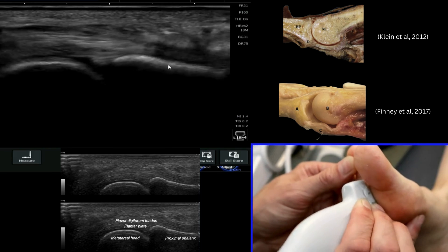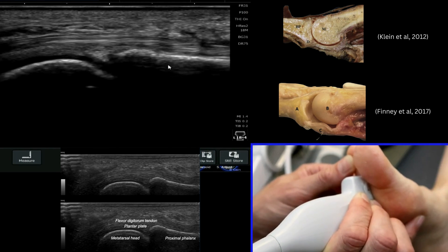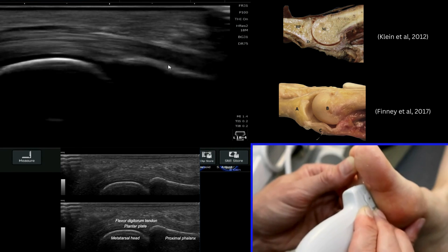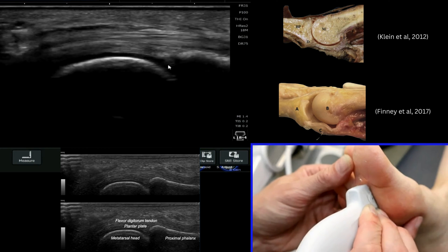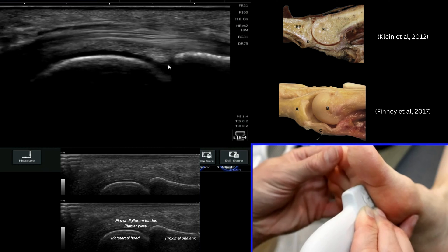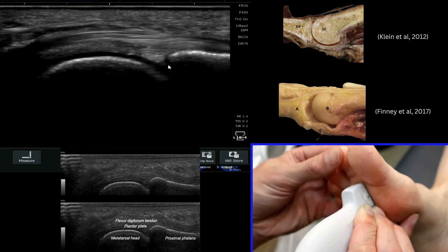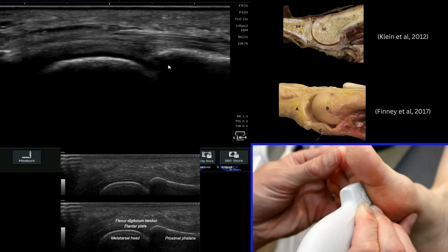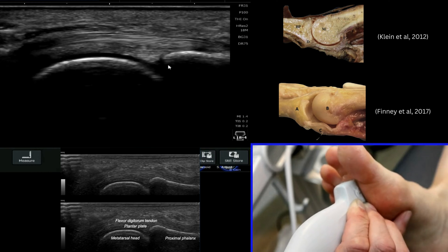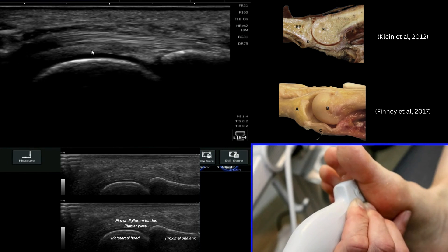If we just bring the probe round slightly we can flatten that out and you can see that straight appearance of the phalanx just above my cursor. If we roll back round to the metatarsal slightly, we can start to utilise differentiation through dynamic movement and have a look at that flexor tendon sitting superficial to the structure we're looking to find — the plantar plate — which sits in this area here.